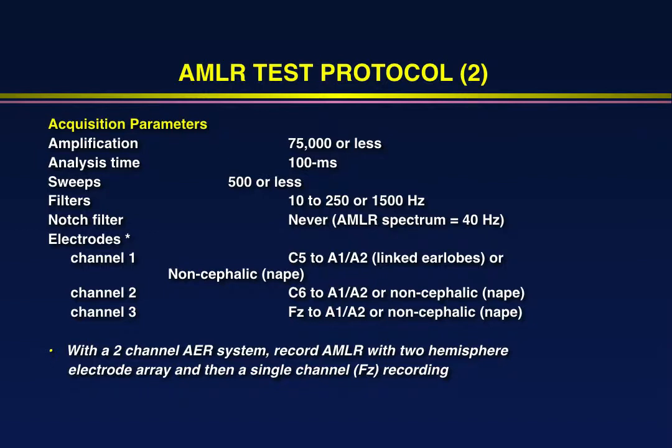And that's why I like the middle latency for any neuroaudiologic assessment when I need to use evoked responses, because I can get hemisphere specific information on primary auditory cortex. That's a vital part of the auditory system. You're not going to process speech properly. You're not going to have normal auditory processing unless primary auditory cortex is functioning normally.